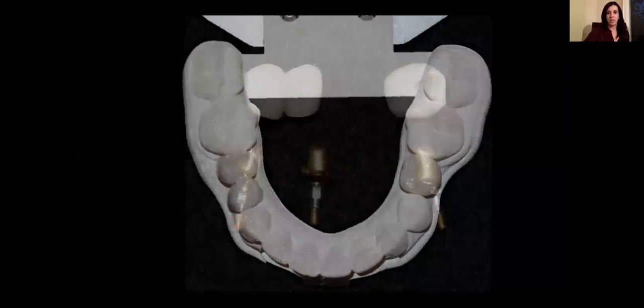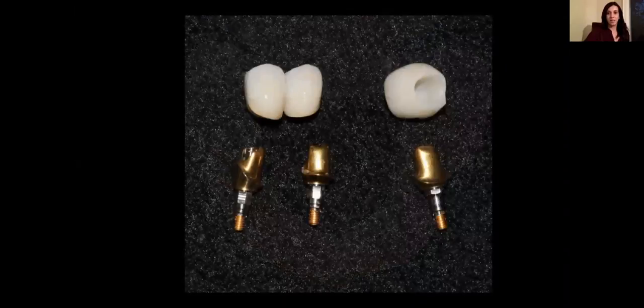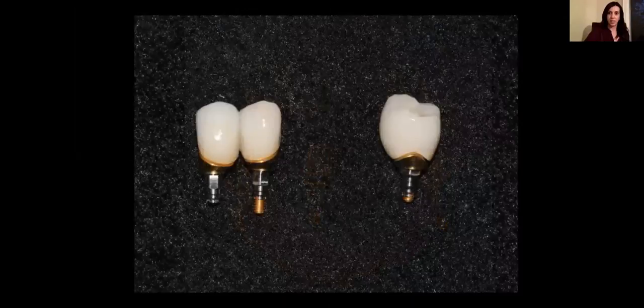So to show you the custom-made abutments, you can see that they're titanium nitride abutments, and you can appreciate from these slides as well, the margins are customized based on the patient's soft tissue. And so here are the crowns seated on top of the abutments.